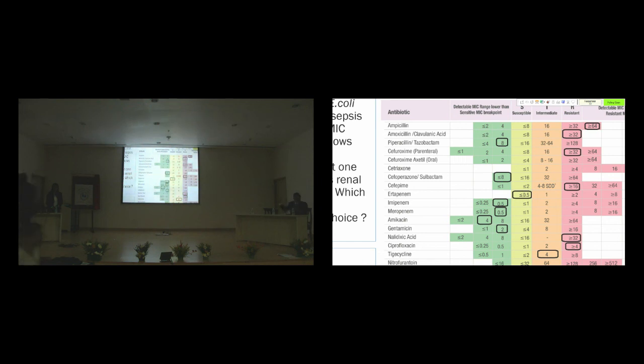In that situation, truly speaking, we can prepare something like this even with disc diffusion diameters: the gap between the breakpoint diameter and the actual diameter, how much bigger it is, and whether that better predicts clinical response. Something like that can be done, but it will be much less accurate as compared to MIC values.